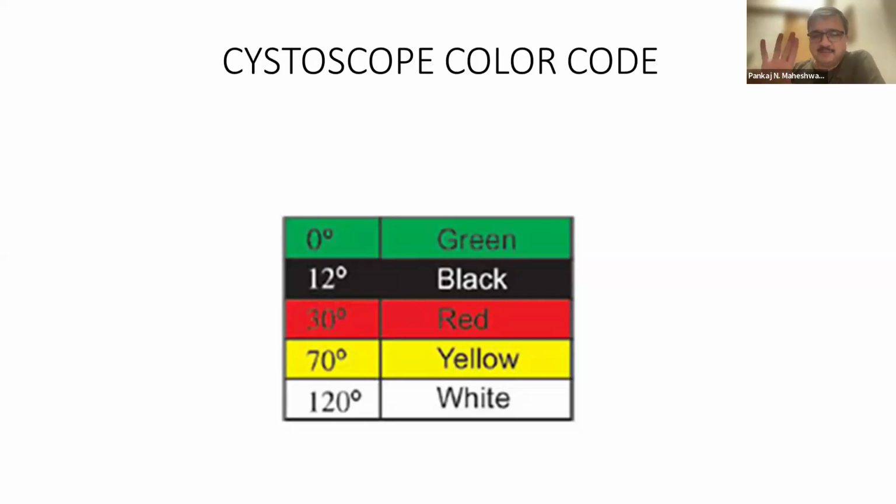But what I remember, and I am subject to be corrected, you people may please reconfirm what I'm saying, is when you say narrow angle, then the field of vision is 90 degrees. Means if I look at 0 degrees, my 0° will bifurcate the field of vision into 45 degrees above and 45 degrees below. But in wide angle, it becomes 120 degrees, so 60° above and 60° below.